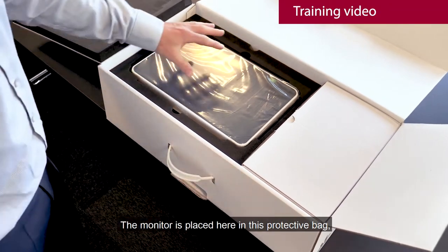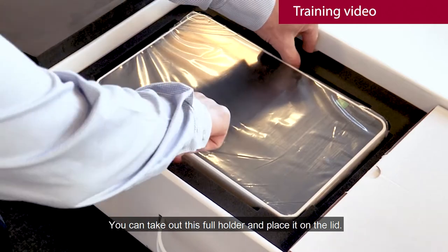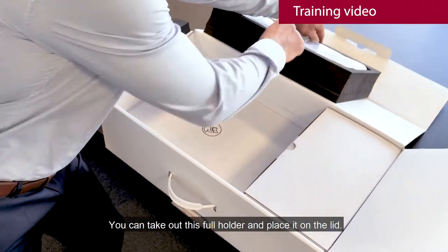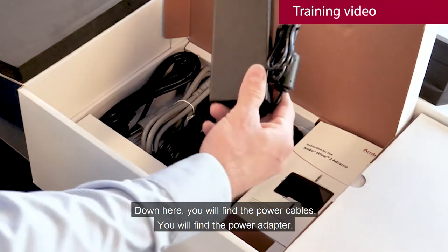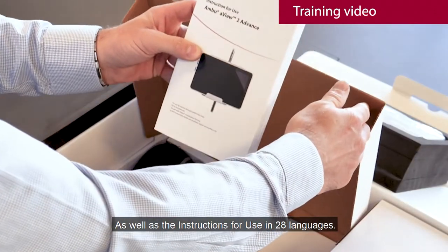The monitor is placed here in this protective bag. You can take out this full holder and place it on the lid. Down here you will find the power cables, the power adapter, as well as the instruction for use in 28 languages.